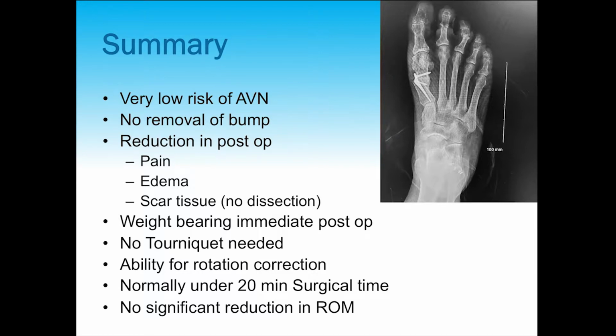But I would say sometimes I do have the long-standing bunions that have some significant medial bump that I have to plane or resect, or maybe lengthen the incision a bit to accomplish that, to cosmetically make sure that the patient's going to be happy. It is reduction in post-op pain because it's such a small incision, less edema, less scarring. They can weight bear immediately post-op, and this is a strong implant, very strong, which limits the post-op swelling versus the old single pin construct.